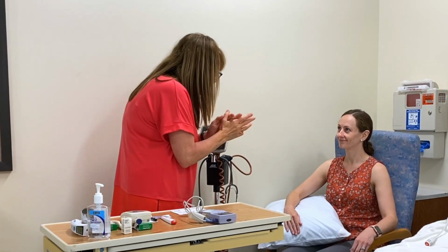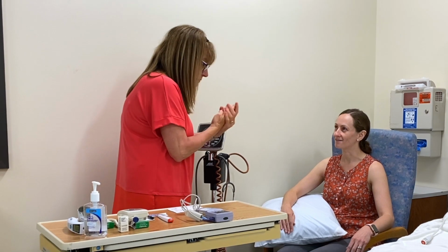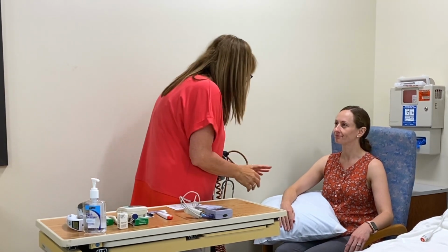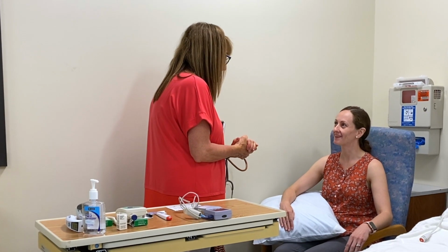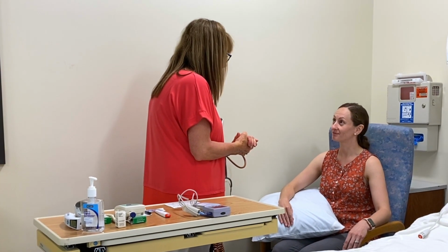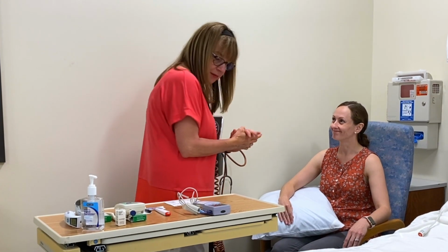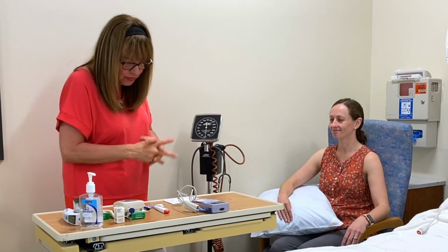All right. So good morning, Monique. My name is Evie, and I'm going to be doing vital signs. Is that okay with you? Good morning, Evie. Yes. For safety purposes, could you give me your name and date of birth? Sure. Monique Blau, and it's October 21st, 1990. Thank you very much. Very good. That's correct. That's what I have with my paperwork. Very nice. Thank you kindly.